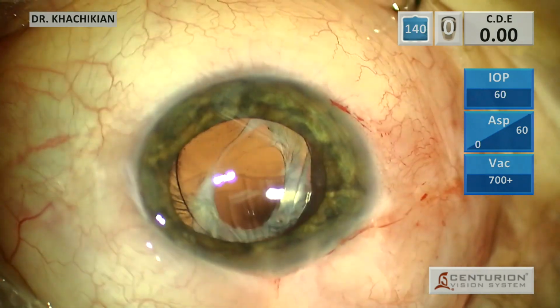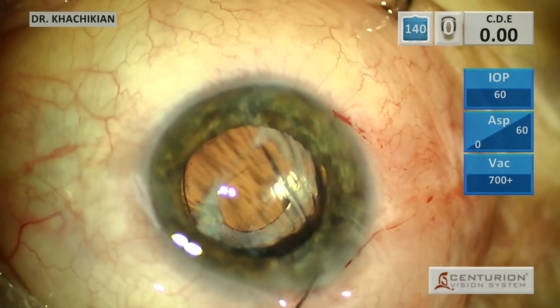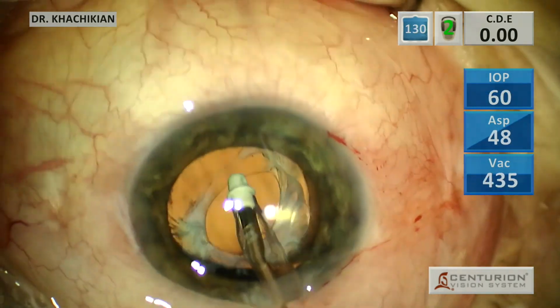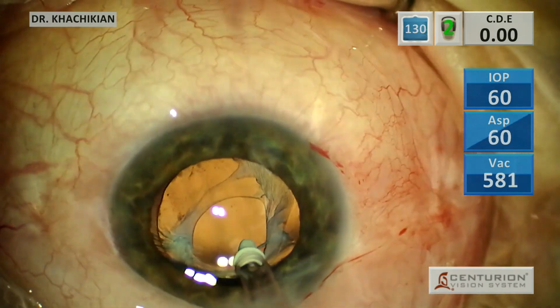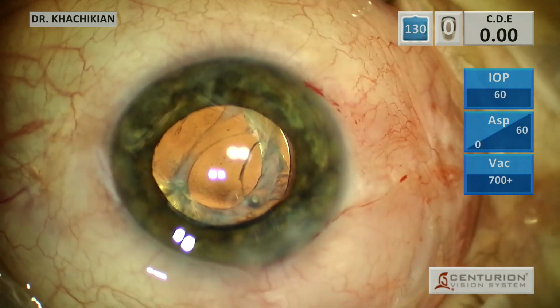At the beginning of the case, I wasn't even sure I'd be able to free up the lens adequately. Now I'm just going to remake that capsular rhexis. So what we'll do is get to the point where we can reinflate with some viscoelastic. Here I am trying to get rid of some of that fibrosis with the IA tip, and it's just too stuck on there.